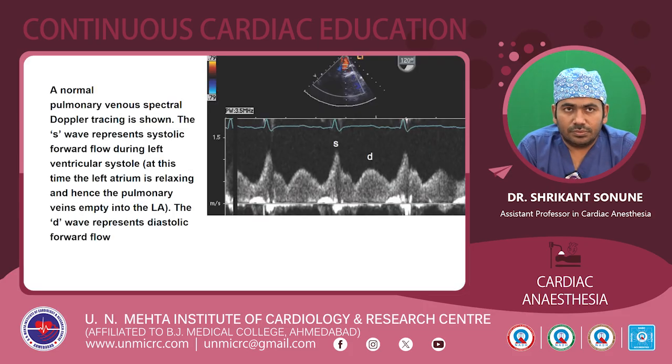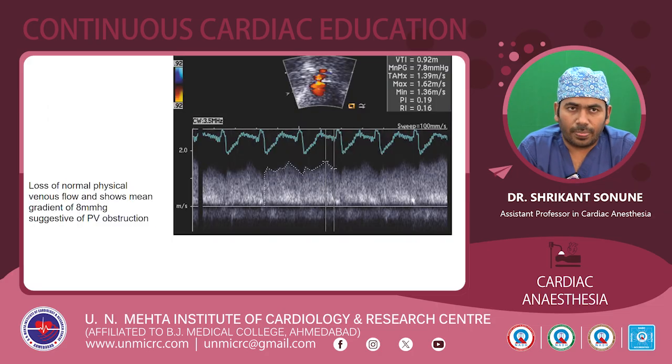This is a normal pulmonary venous spectral Doppler tracing, showing the S wave and the D wave. In the pediatric population, there is no separate delineation of the S1 and S2 waves. Prominent S and D waves can be seen here. The S wave, as we discussed earlier, represents the systolic forward flow during left ventricular systole. At this time the left atrium is relaxing, and hence the pulmonary veins are able to empty into the LA. The D wave represents the diastolic forward flow.